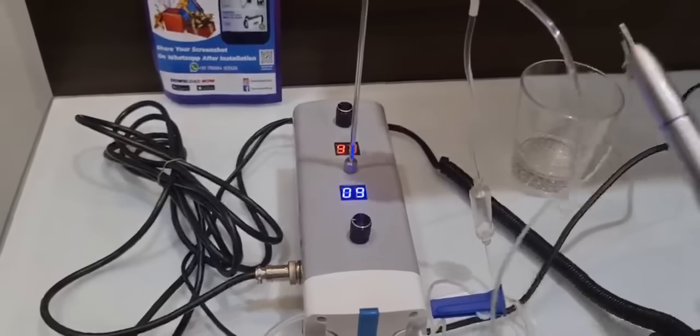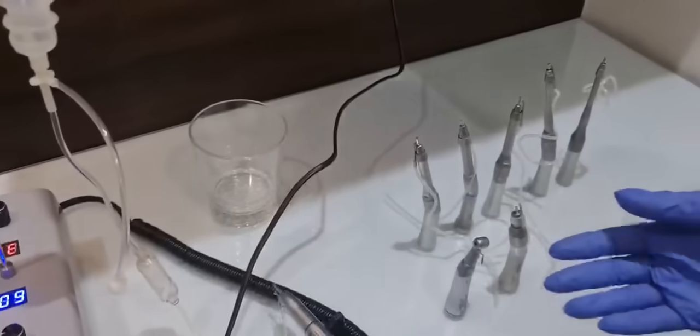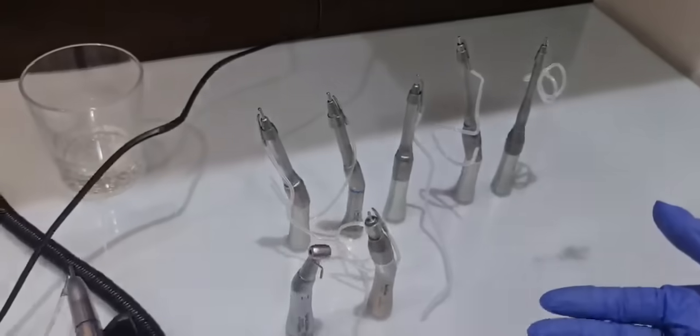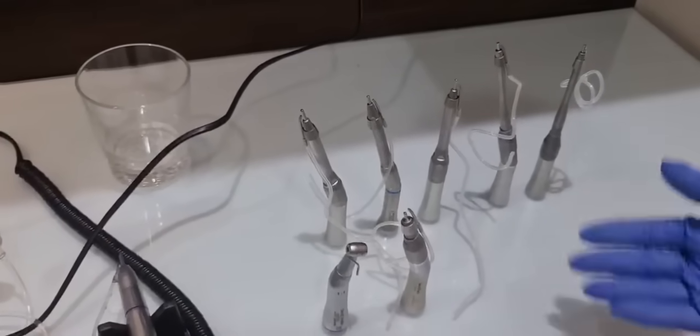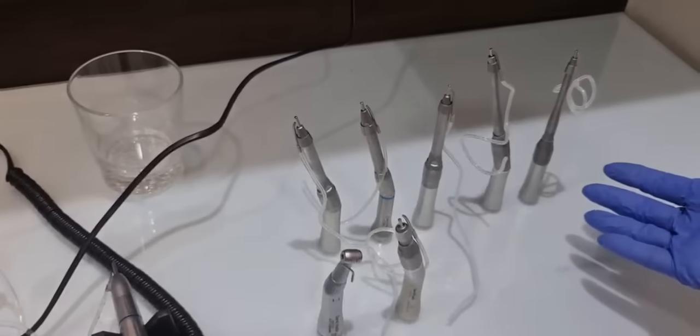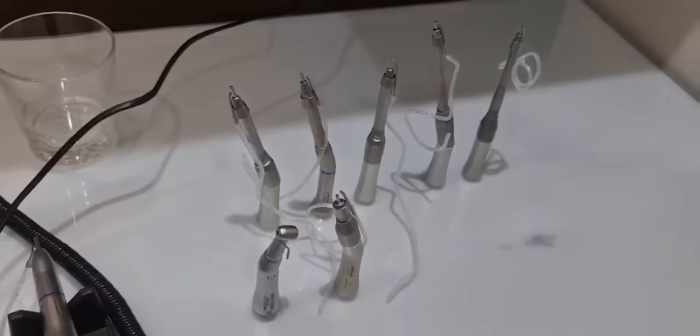The handpieces which can be used with this surgical brushless E-type motor include contra-angle one-to-one, straight angulated, and straight ones, as well as the ones which are used for ENT surgeries. These handpieces can also be attached with this motor.